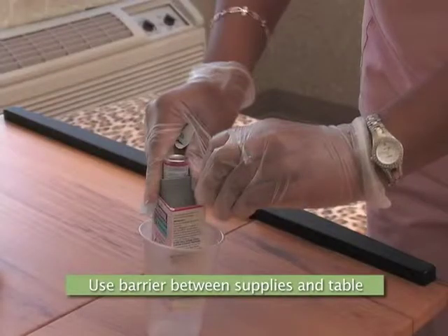The barrier can be a clean tray or empty cup in which the medication and other supplies are carried into the resident's room. This provides a barrier between the supplies and the over-the-bed table or other surface on which the supplies are placed while the medication is administered.